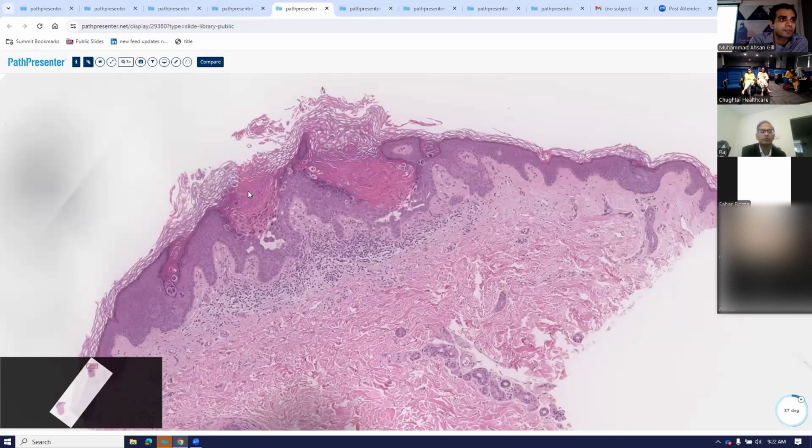But again, they can look very, very similar. The clinical input is very, very important, like whether the patient has the clinical symptoms of Darier's or whether it is Grover's. But focal acantholytic dyskeratosis is the term that people also use for Grover's. And if you keep that in mind, then you will see all the features. It is focal, there is acantholysis, and there is dyskeratosis.